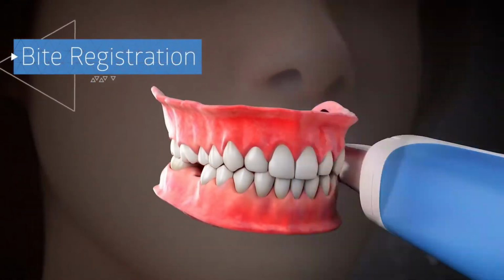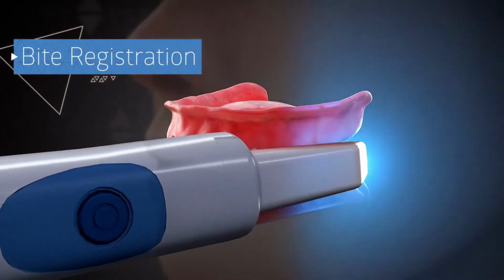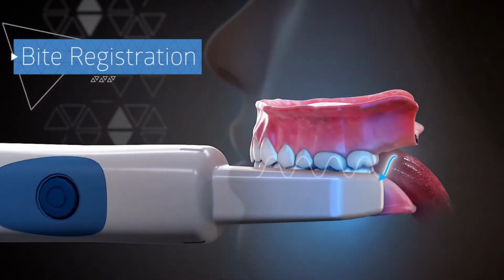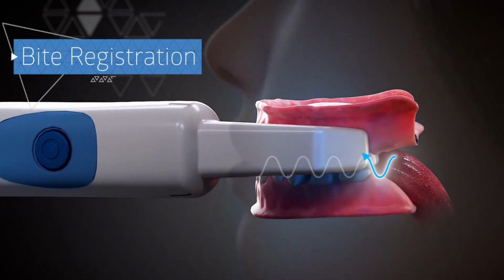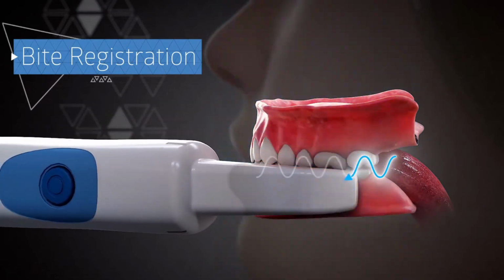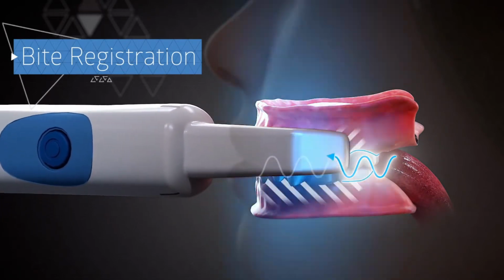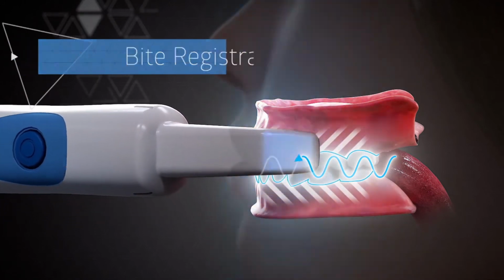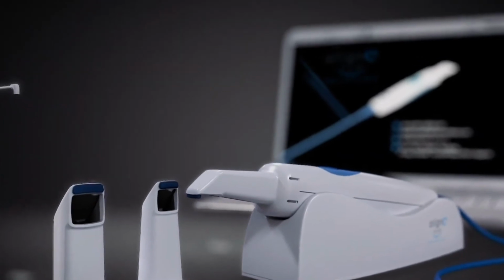Scanning bite registration requires that the teeth are in correct occlusion. Place the tip as far distal as possible and make up and down movements, pulling the scanner forward, making sure that its tip is parallel to the scan surface. Make sure that the gingival margins of the teeth are captured to enable easy alignment at a later stage.